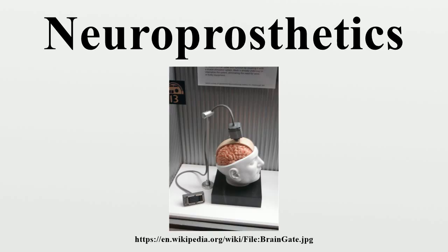Cochlear implants provide an example of such devices. These devices substitute the functions performed by the eardrum and stapes while simulating the frequency analysis performed in the cochlea. A microphone on an external unit gathers the sound and processes it. The processed signal is then transferred to an implanted unit that stimulates the auditory nerve through a microelectrode array.